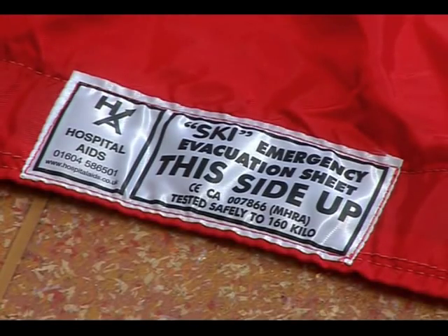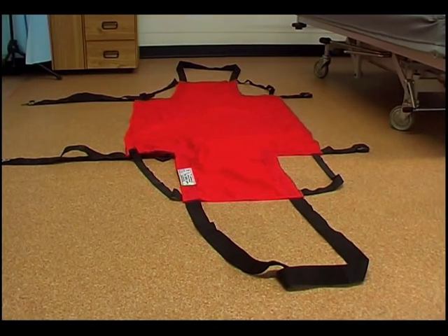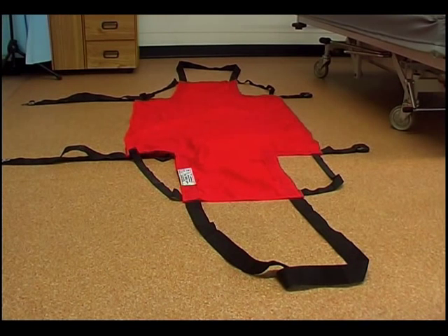As you will see from the ski sheet label, the components are safe load tested to a maximum weight of 160 kilos, although the maximum load to be pulled downstairs by carers needs to be carefully assessed by your own manual handling advisers. The most important issue to be considered is the weight of the carers pulling the ski sheet relative to the weight of the mattress and patient or resident combined.